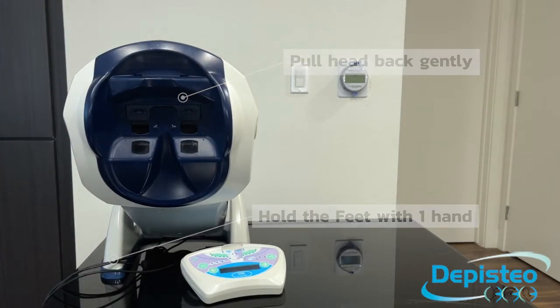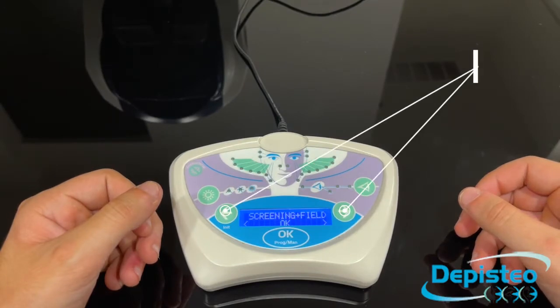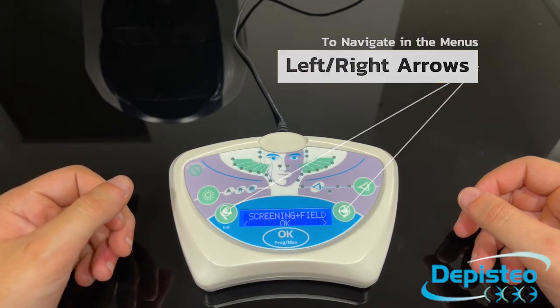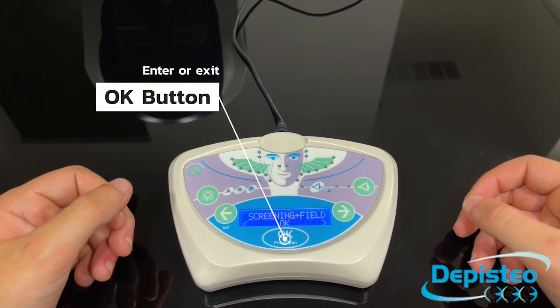You are now ready to use your machine. Let's quickly take a look at the layout of the remote control. The left and right arrows are used to navigate through the menu. The OK button is used to enter or back out of a menu.